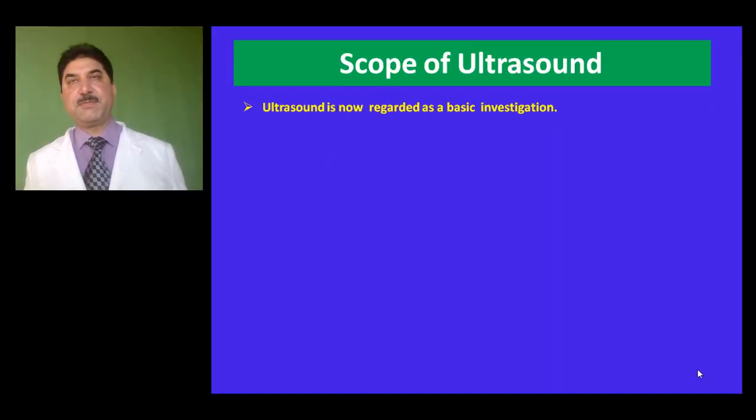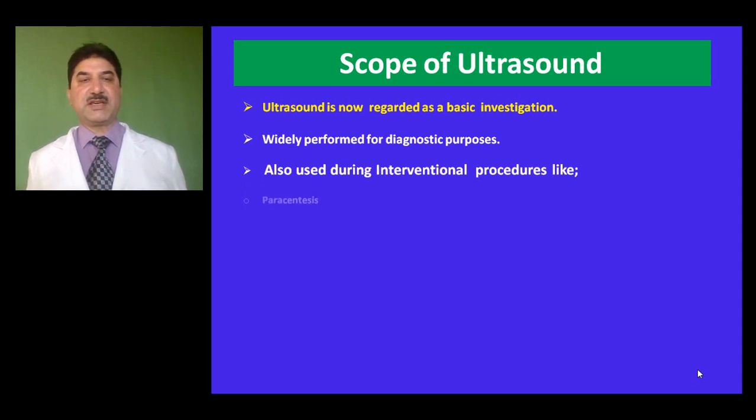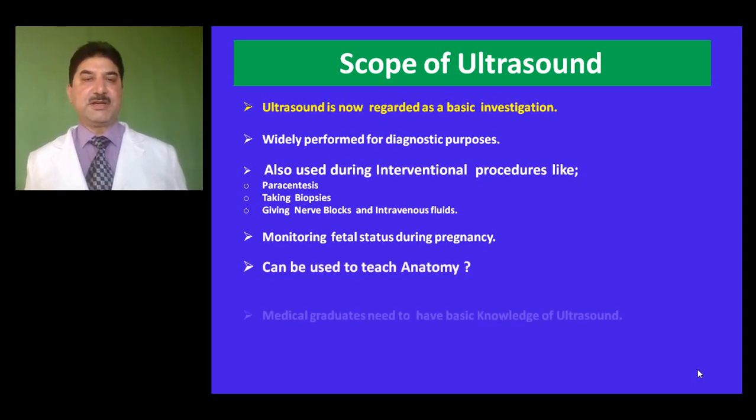Ultrasound is now regarded as the basic investigation. It is widely performed for diagnostic purposes. It is also used during interventional procedures like paracentesis, taking biopsies, giving nerve blocks and intravenous fluids. It is also used for monitoring fetal status during pregnancy, and can be used to teach anatomy.